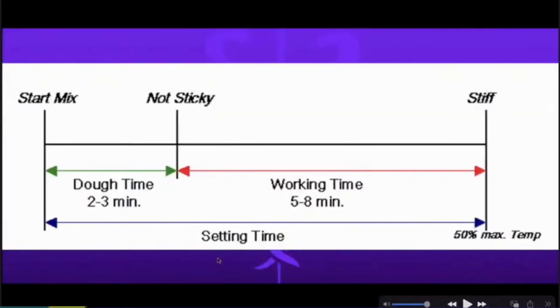Very important slide, one or two things. Keep your cement in the refrigerator, the lower box, or just next to the freezing section. And even your saline, I won't mind if I have a frozen saline coming into my trolley, but it should be ice cool saline. Because your cement hardening is temperature dependent. It all depends on how much dough time and working time you have. You get more working time if your cement is cooler than the atmosphere. So we keep the OT also very cool.